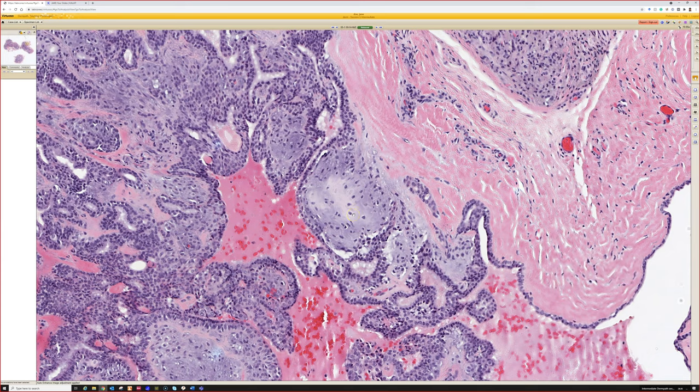It's kind of chondromyxoid. I like the chondromyxoid concept because chondroid and myxoid, both of which have bluish ground substance in the background, have a very close overlap. So sometimes it's hard to tell apart chondroid and myxoid because they can coexist. Because of that, if you think something looks like cartilage, keep myxoid tumors in your mind too. If you think something looks myxoid, always remember that chondroid tumors can sometimes mimic myxoid.